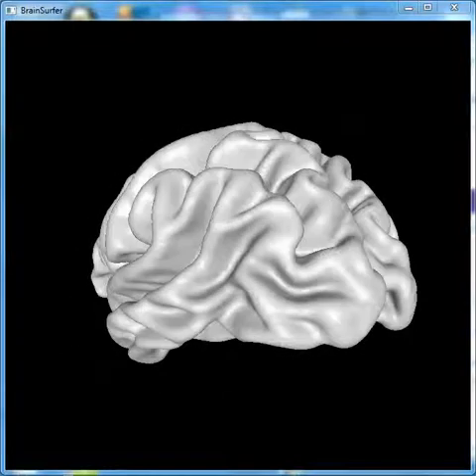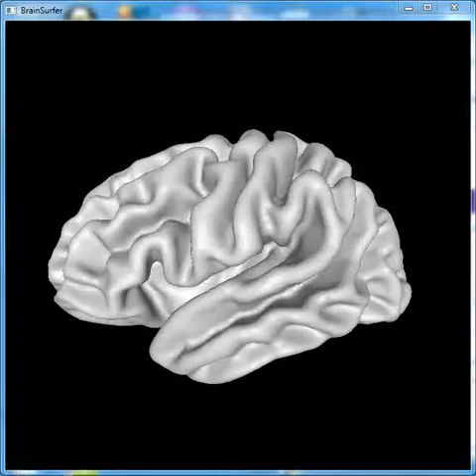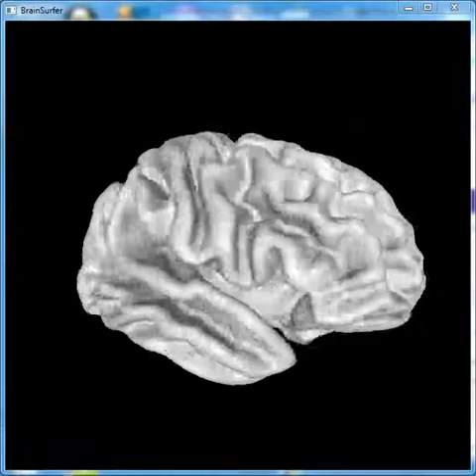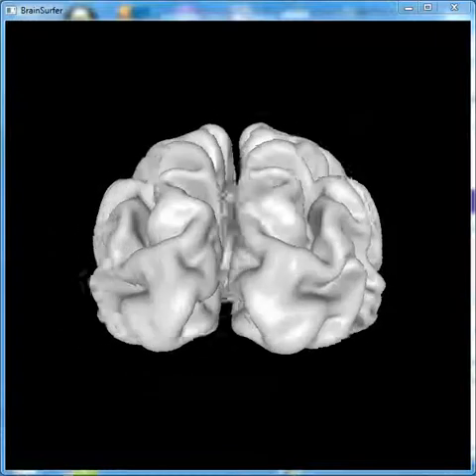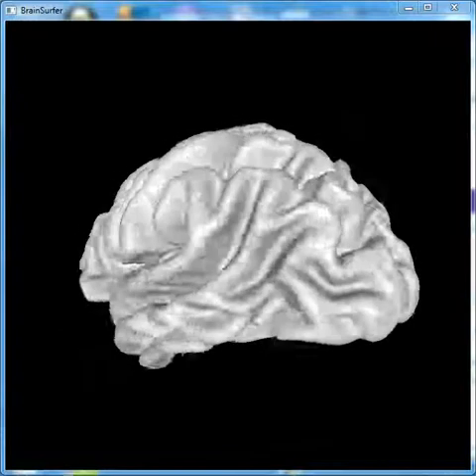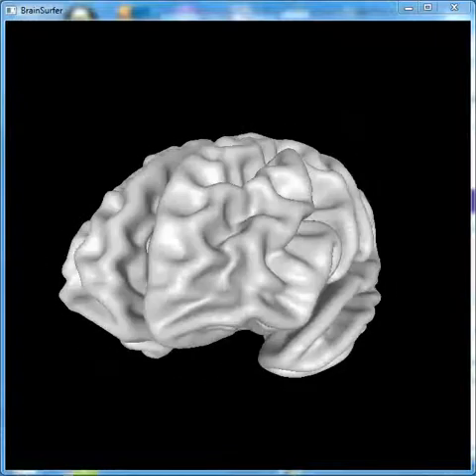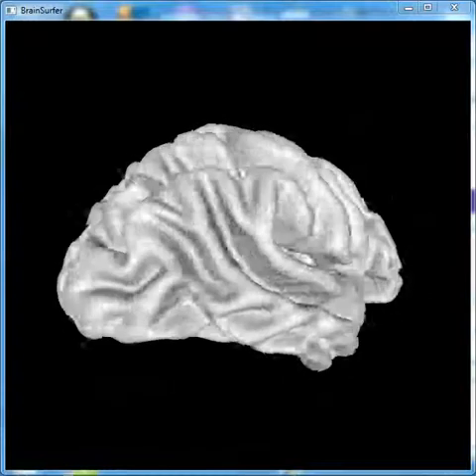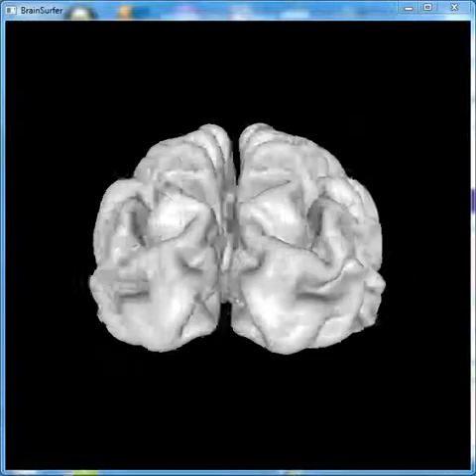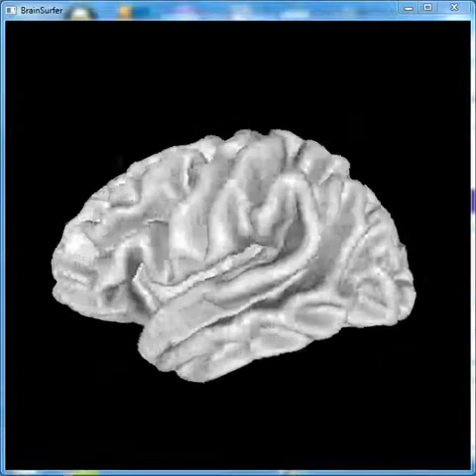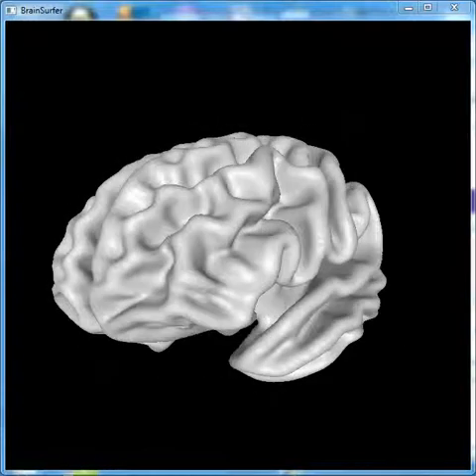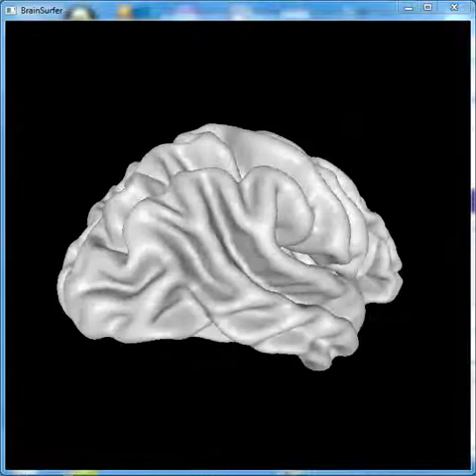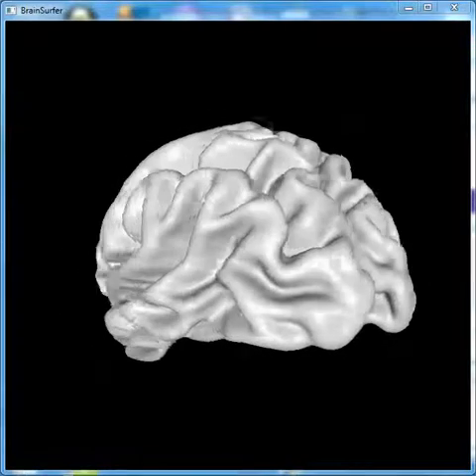This is the Applied Neuroscience Brain Surfer program, an add-on to NeuroGuide Deluxe. We have Brain Surfer 1, which is the current source density produced by sLORETA in 88 different Brodmann areas, which serve as nodes of networks of different types.